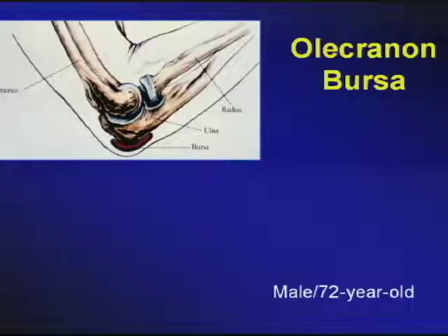One of the things that we forget, because we usually concentrate on the intra-articular portion of the elbow, is that on the periarticular structures you may have some bursae. Case in point, you can appreciate in this diagram the olecranon bursa. Note that the bursa wraps around the olecranon process and that indeed it has a distal portion to it. This is going to be important because you have to address the olecranon bursa from the distal humerus all the way to the proximal forearm, in this case the ulna, in order to capture the structure in its entirety.